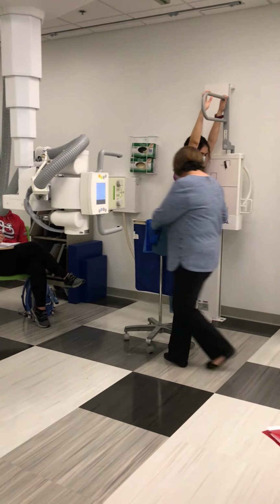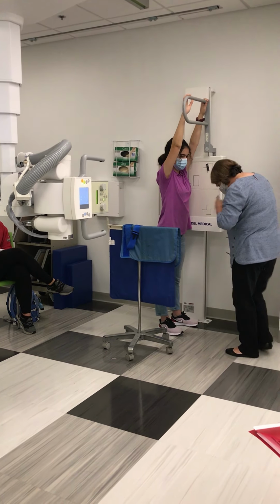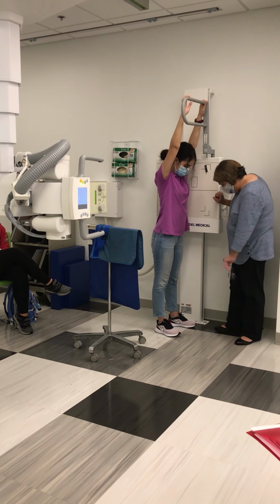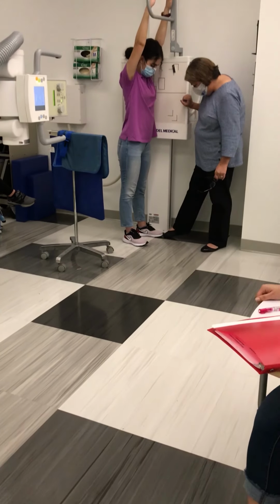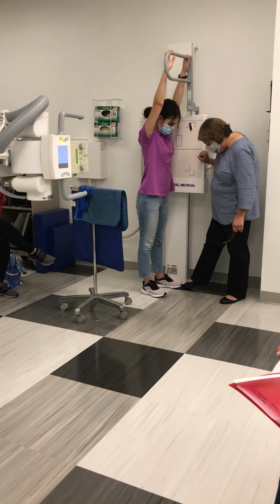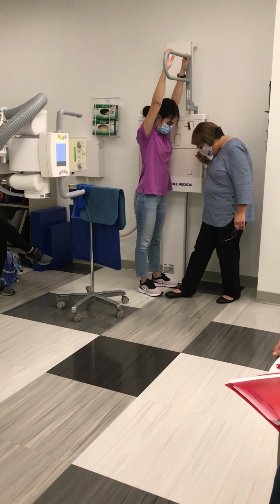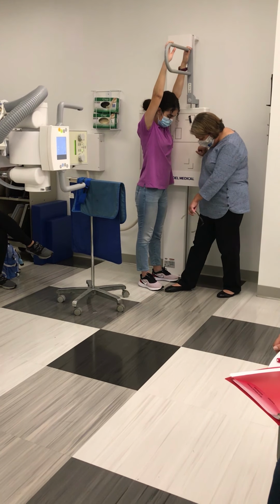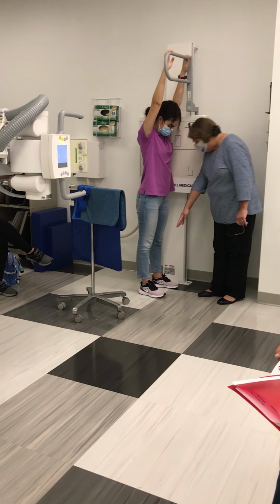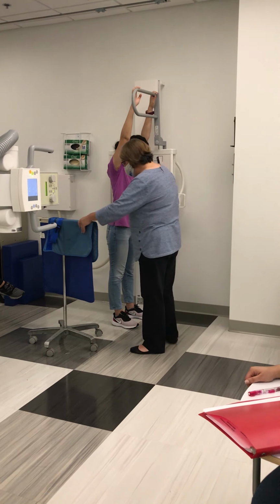All right. We want to make sure that there's no rotation, that our patient is in a true lateral. One of the ways you can tell is the placement of the feet. Don't move your feet. So I can tell that her toe on her left side is a little bit in front of the right foot. So I'm just going to plant my foot here and say, can you just scoot that right foot forward to my foot? There you go. So they're straight across now. So that's more likely that she's lateral.